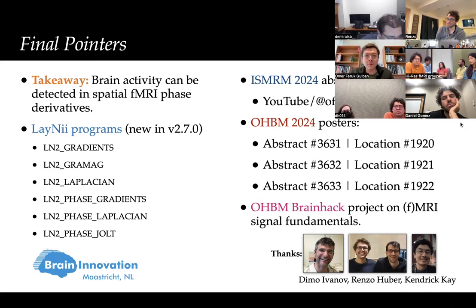Then you need to brain mask. Then if you want to look at the voxels that are at the edge of the brain, they're outside of your mask. Maybe just a bit of a spicy take, but I do not like FQSM stuff because of this pre-processing point of view. And I think we can maybe do away with some of the things that they do and focus on the origin of the contrast and maybe pull it up with derivatives, phase derivatives.